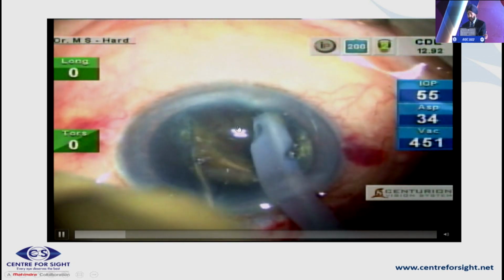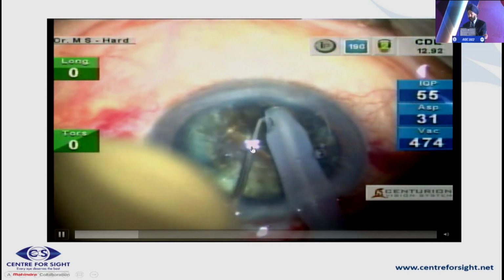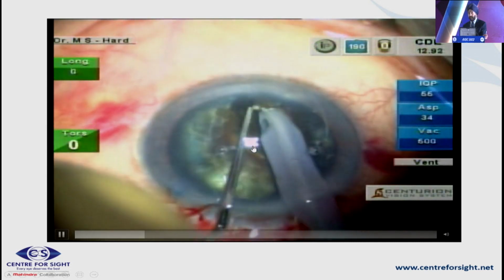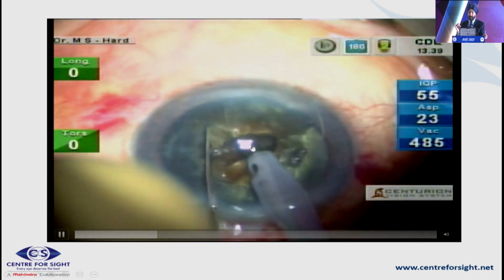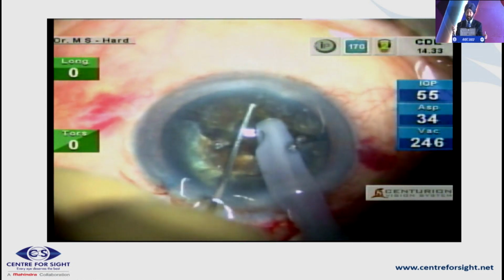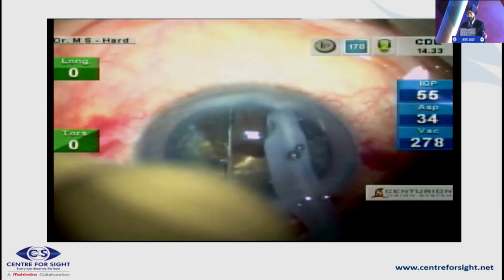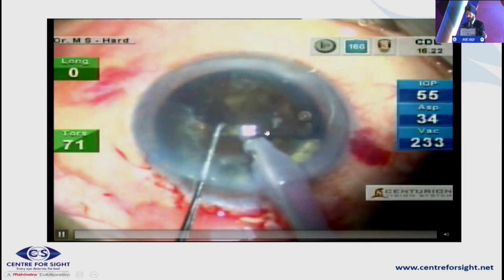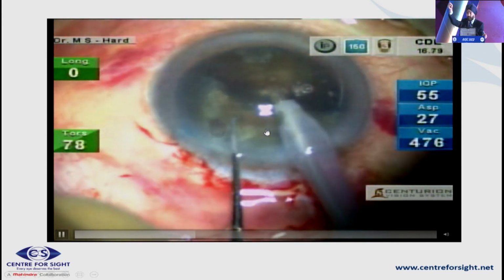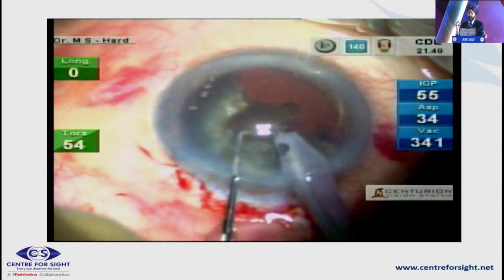What is very, very important is, look here, crack in the midline. Can you see this crack in the midline? Until you are able to crack in the midline, these things will interdigitate and come out together. Now again, I have rotated it 180 degrees, and you can see again that I am trying to get this split. Can you see this? Just watch. Once you have got this split right into the center, then only try to remove the fragments.